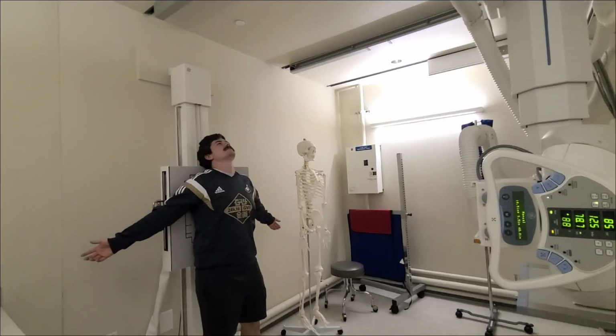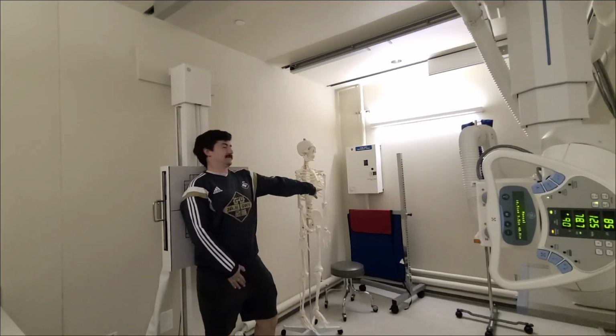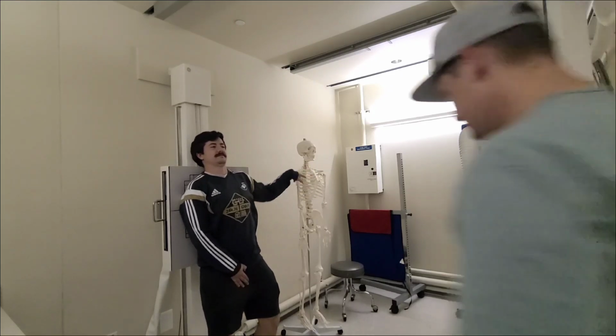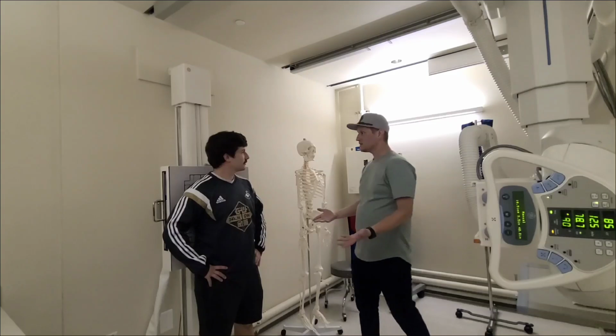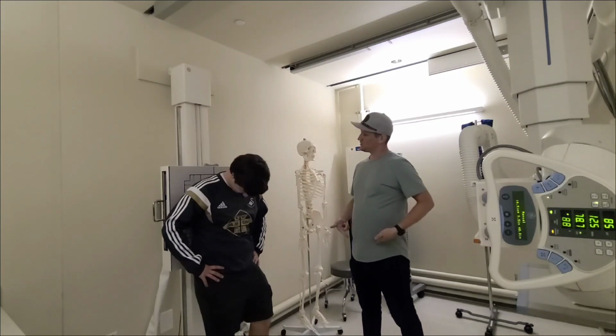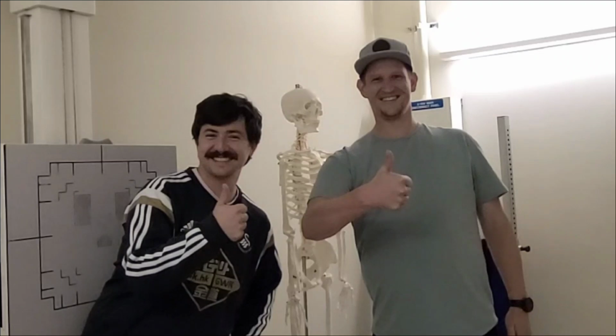A patient may ask for shielding to protect anatomy that is not of any interest. Shielding recommendations have changed recently, and it may be safer for the patient to remain unshielded, as the lead barrier can cause scattered radiation to rebound off the inside of said barrier and expose the patient more than necessary.